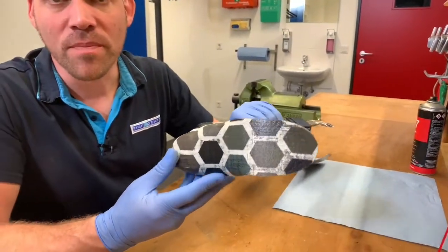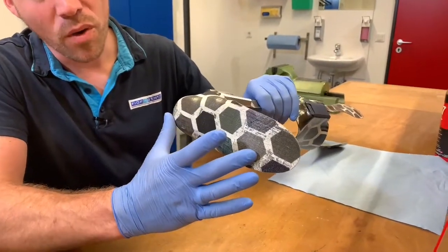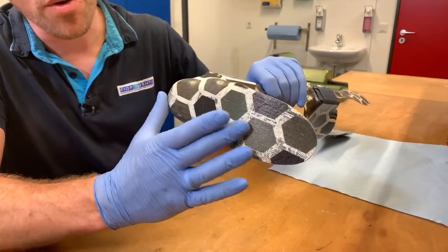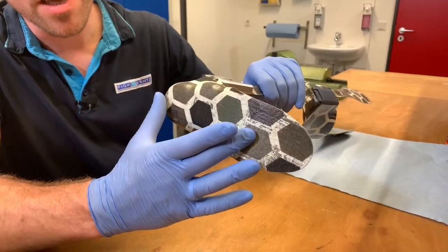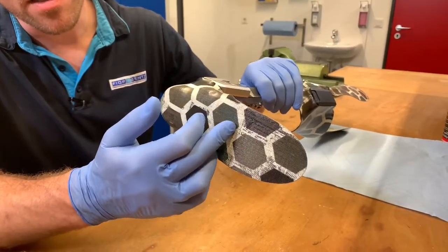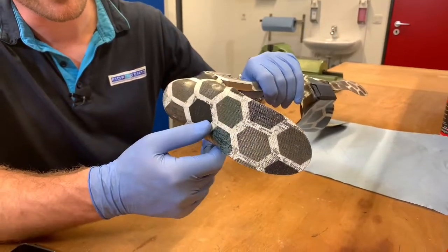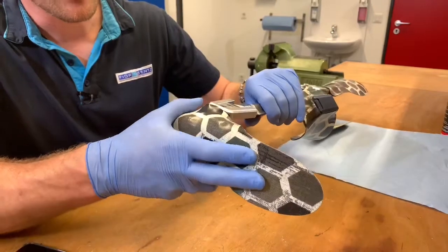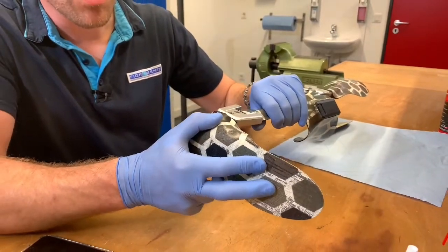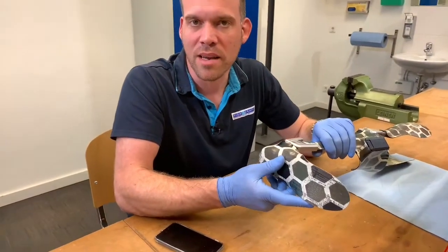We take a special look at the foot piece because the forefoot area is very important from a functional point of view — it is the actual forefoot lever. So we check if there are any cracks, or even worse, splinters in the laminate, and if it is still as stiff and stable as it was after it was fabricated.